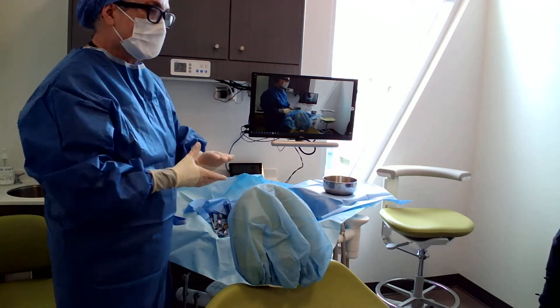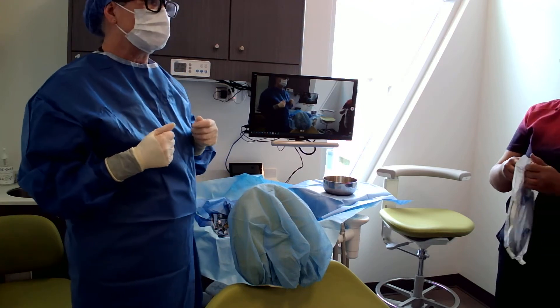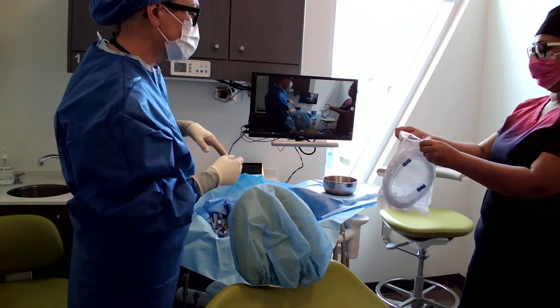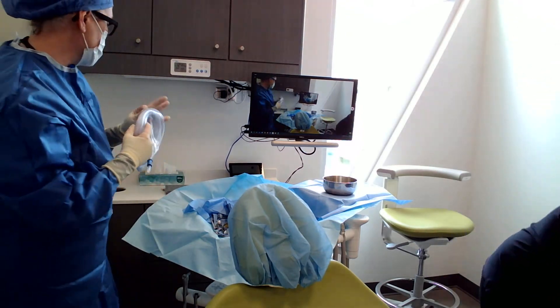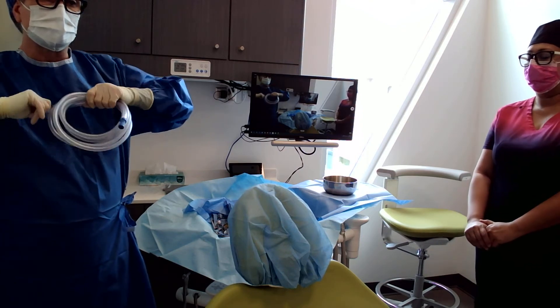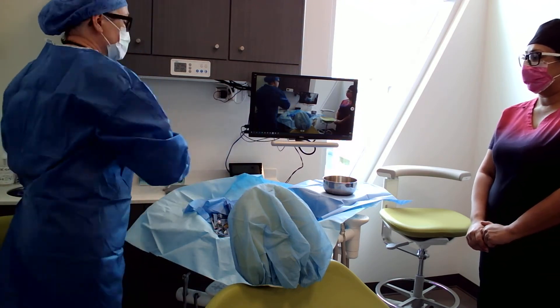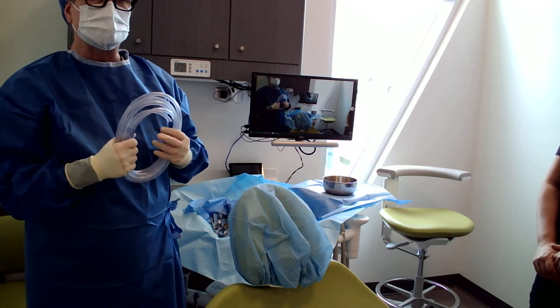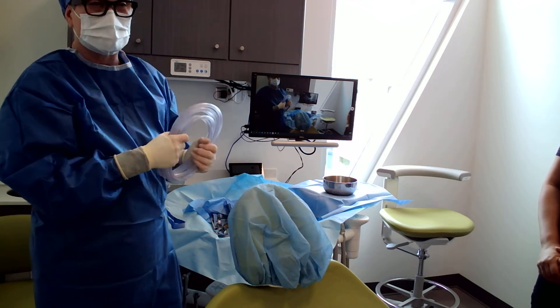I'll take that suction tubing, please. We're assuming here that we have a closed suction system, which would be a canister on the wall. This is an open suction system that we have here at the college, and that is fine — except the suction tubing is sterile and the system is just clean. Even though we run evacuation fluid through our suction lines using sterile HVEs and LVEs, there's always a risk of backflow. With a closed canister system, there's zero risk — those canisters are disposed of after every patient.